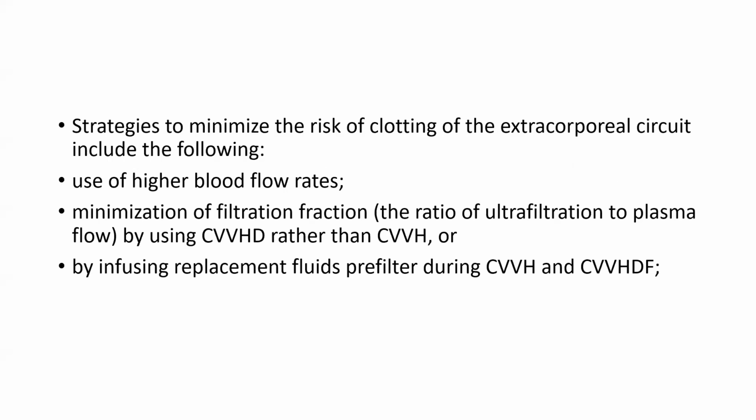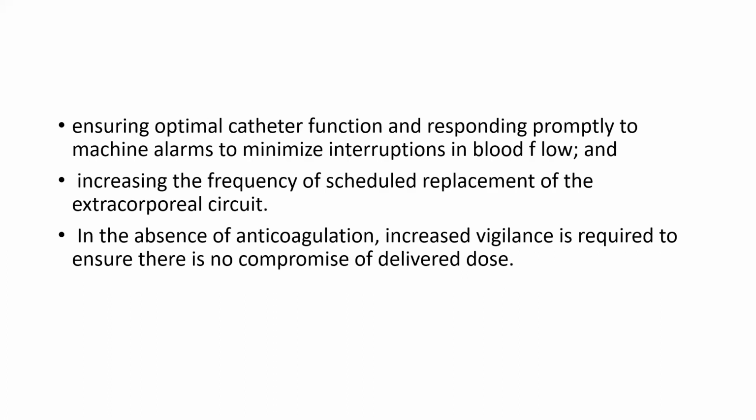Strategies to minimize the risk of clotting in the extracorporeal circuit include the following. Use of higher blood flow rate, minimization of the filtration fraction by using CVVHD rather than CVVH, or by infusing replacement fluid pre-filter during CVVH and CVVHDF.